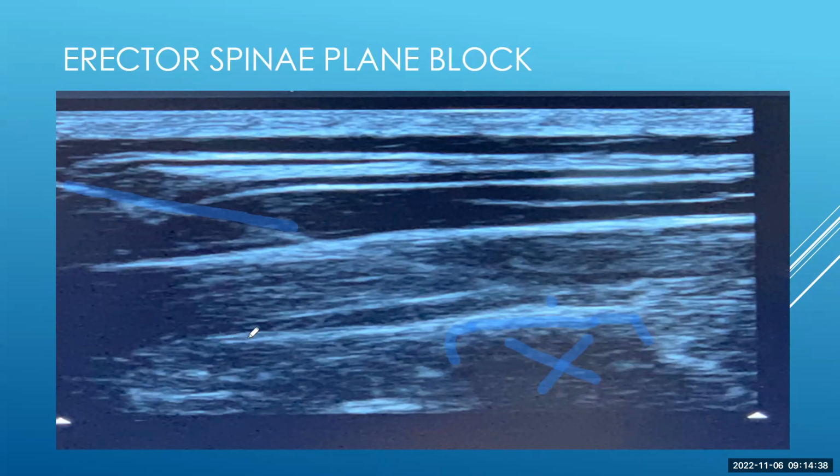Versus with the fascial plane out in here, we can see past it. While it is hyperechoic, all of these, you see the different muscle groups. And so as we're getting to this area, we can still see past it. And that's when we know that's more like a fascial plane versus something like this would be bone, because we don't see anything after that. And so this wouldn't be a fluid compartment. This would just be as a result of the sound waves coming in contact with a bony structure.